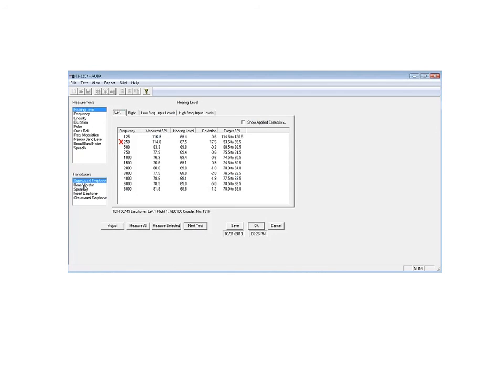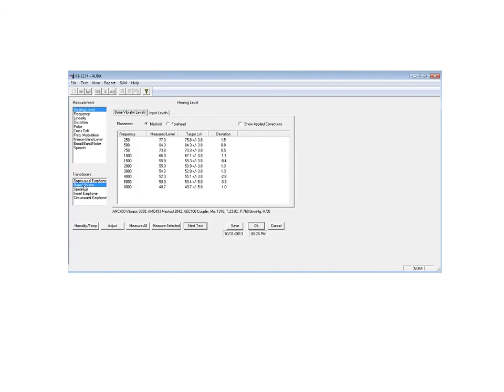We can also go and do the bone vibrator, again, with the audit testing.